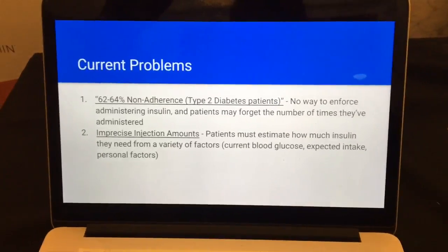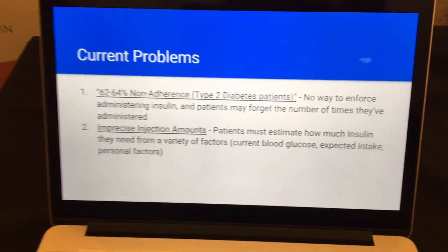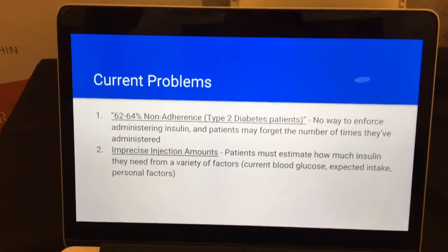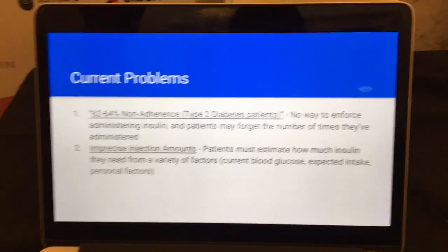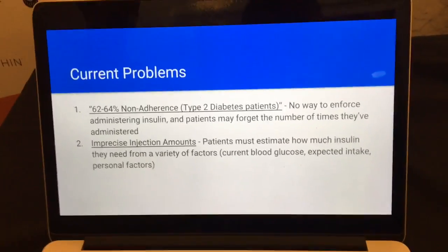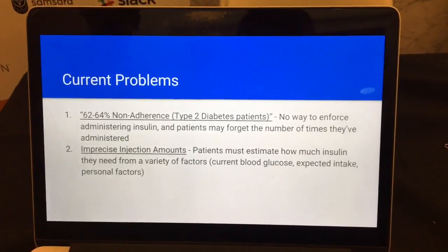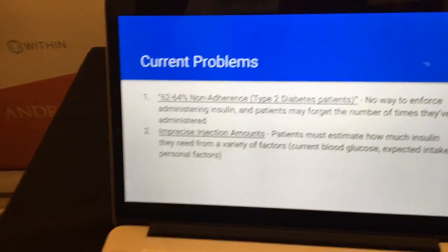And so diabetic patients need insulin because their body doesn't produce enough insulin, and thus they need insulin from external sources. And the second problem we focused on was the problem of imprecise injection amounts. And what this means is that diabetic patients currently must estimate how much insulin they need every time they take a shot.